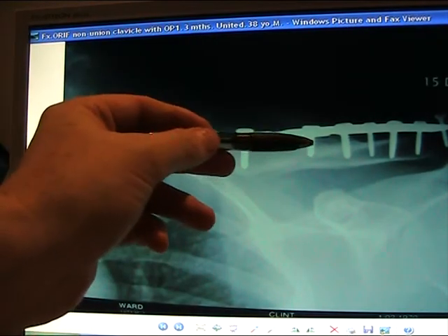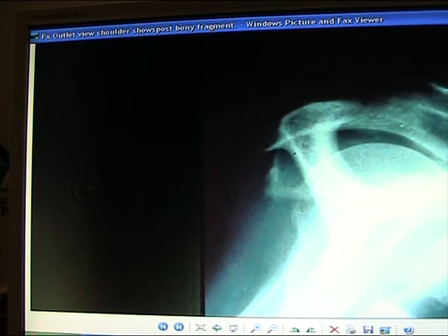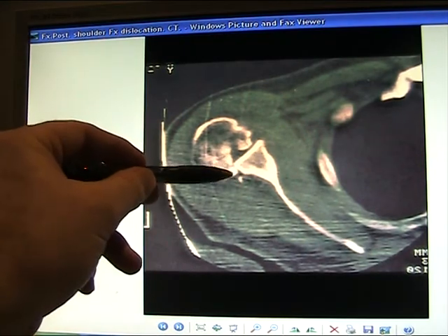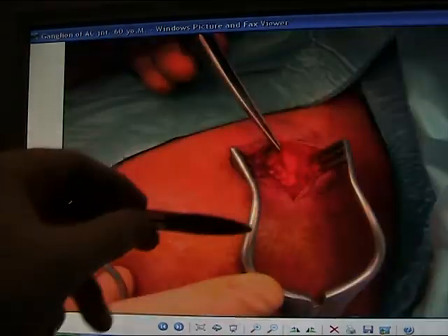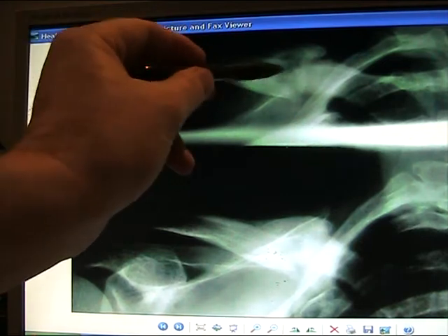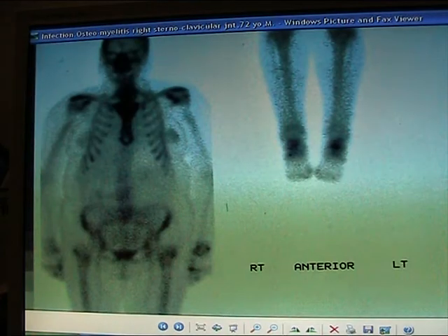There's a fracture non-union fixed with reconstructive plate, bone graft, went on to union. That's in an adult. Posterior shoulder dislocation locked over the back of the glenoid. Rush pins used for fixing fracture of the neck of the humerus. Ganglion excised from the AC joint, there it is being excised. A healing fracture of the clavicle, remodeling. There's a hemiarthroplasty placement for a fracture of proximal humerus.